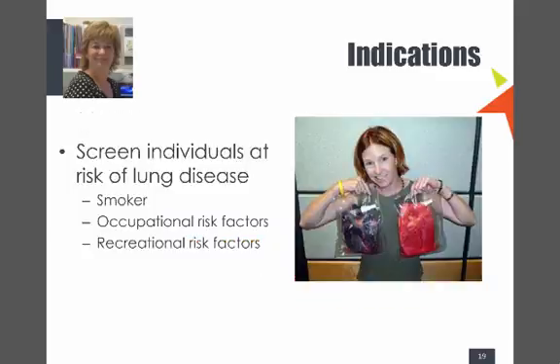And also we can screen people. So you're probably often asked to screen people who are smokers. Not all smokers have COPD. I see a lot of people who've been on inhalers or who have started on inhalers while they're in hospital, and I'm asked to go and talk to them about their new medications. I do a spirometry and it's normal. If they don't have obstruction on their spirometry, they can't have a chronic obstructive pulmonary disease, which is COPD.